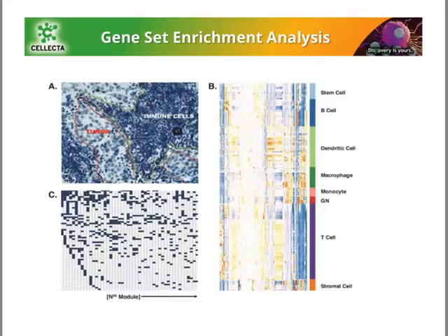Back to the story of immune cell components, this is how the assay would read. On the left, if you look at a pathologist's report, you would probably have infiltrating lymphocytes or a few cell types being presented. And on this assay on the right, you can see all of these orange, as you can see dendritic cells lighting up, you have macrophages, T cells, and all of these cells. I can show you this data. In the interest of time, I'm running through this information.